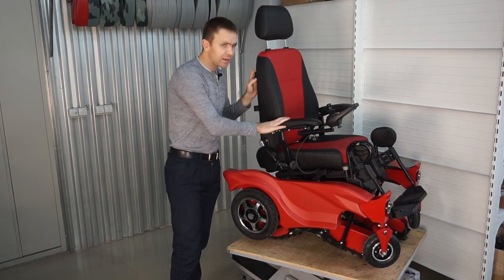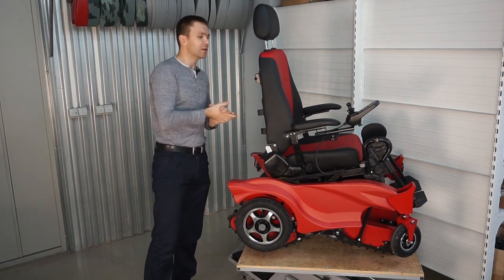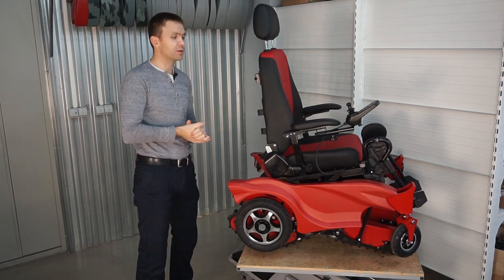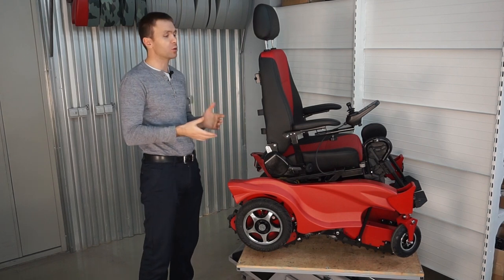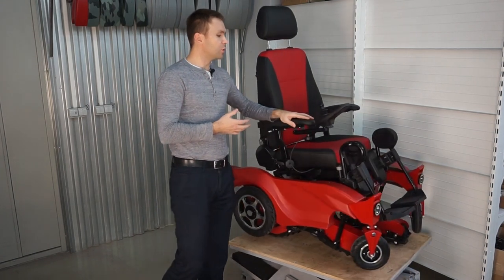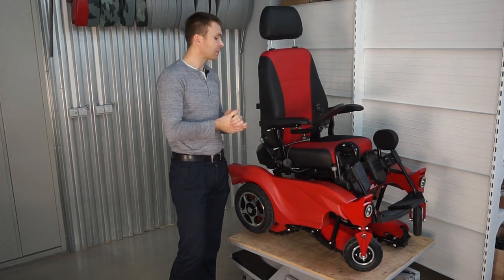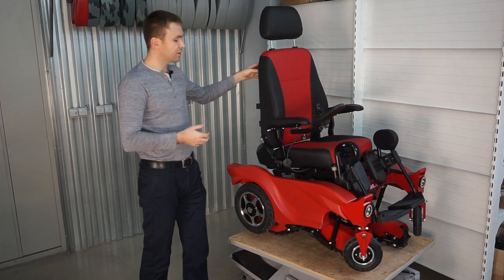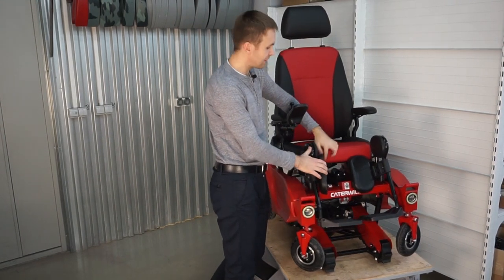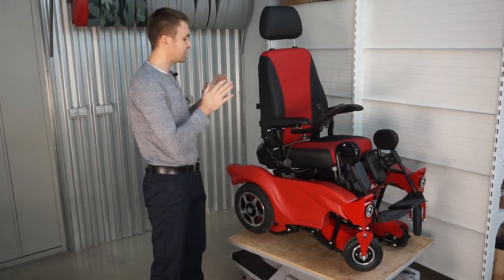The GTS 5 has an optional attendant joystick. If the person cannot control the joystick well by themselves — for example children, elderly, or people with shaking hands — the attendant joystick can be added. There is a socket under the seat for a second controller, so both controllers can be installed on a single wheelchair simultaneously.